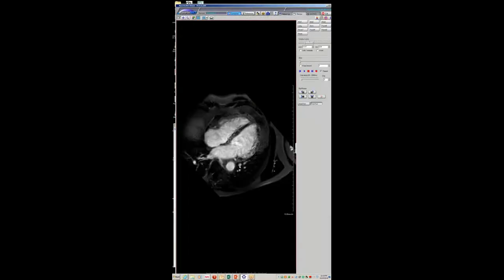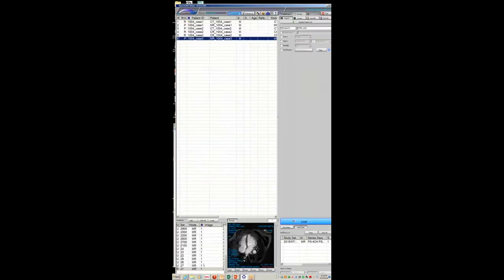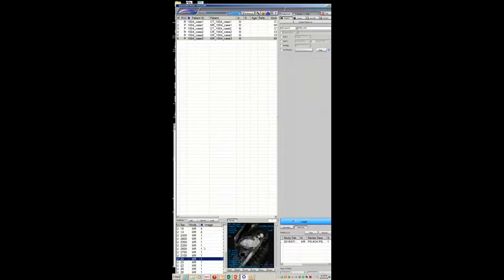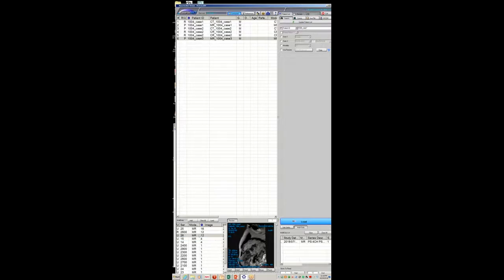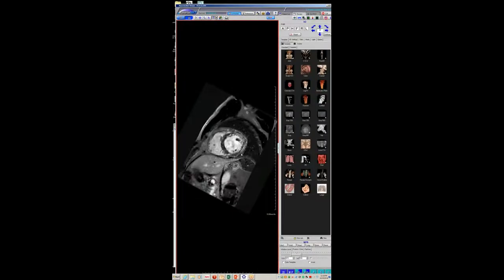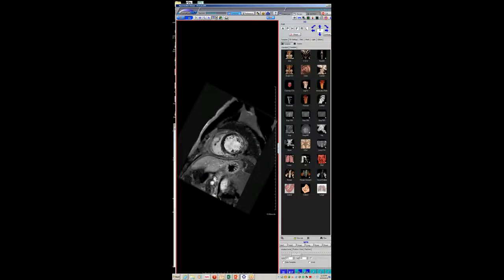Is this just cardiomyopathy or is there active inflammation? No, she's been treated — it's all now myocardial fibrosis. This will not ever get better, it won't ever recover. We can see the myocardial fibrosis is involving the subepicardial and mid-myocardial portions, even some subendocardial areas.